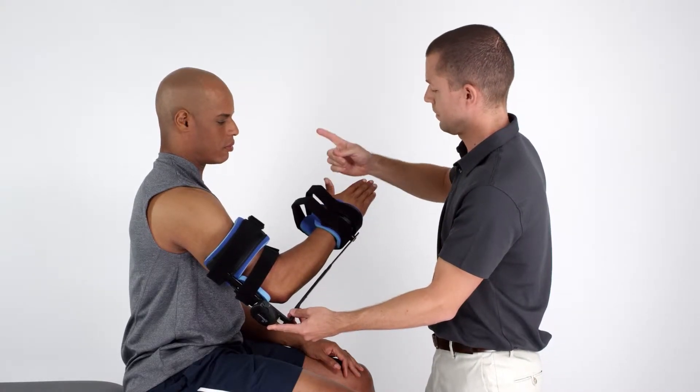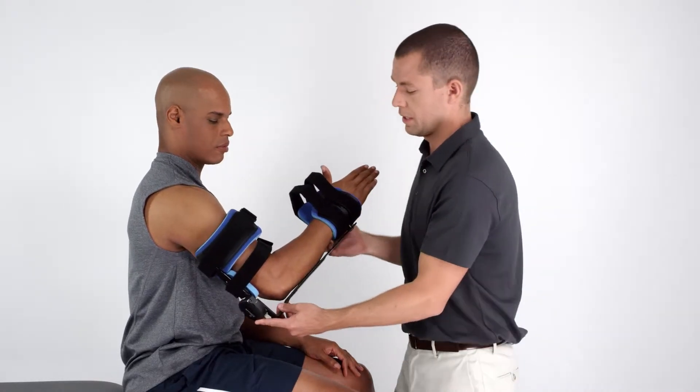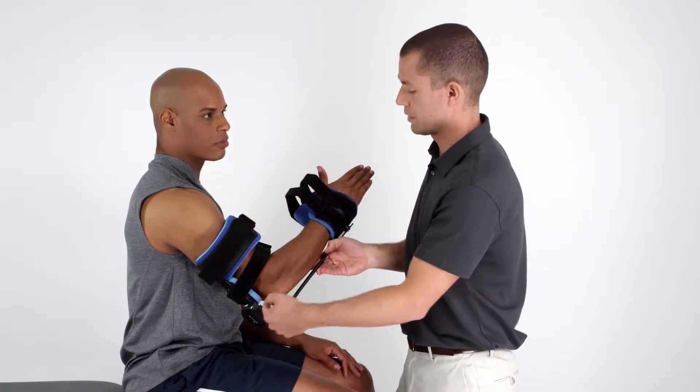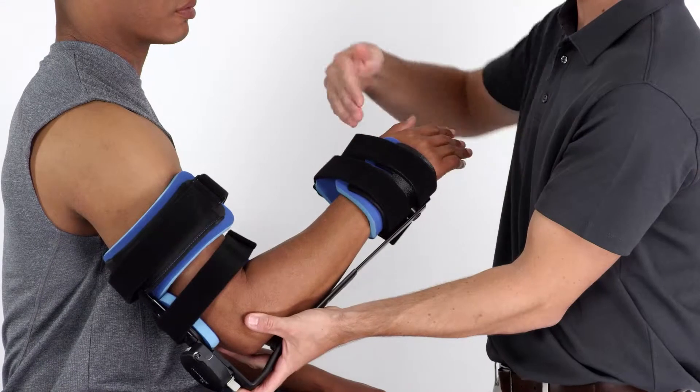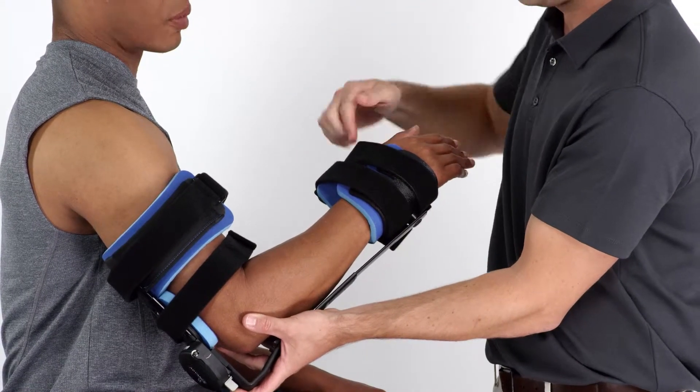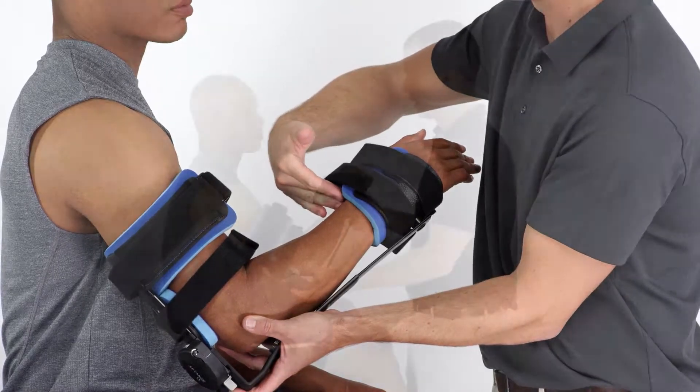Align the device so the center of the tension spring cover lines up with the joint axis of the elbow. The hand and wrist cuff should be aligned to cover both the palm of the hand as well as the end of the forearm.